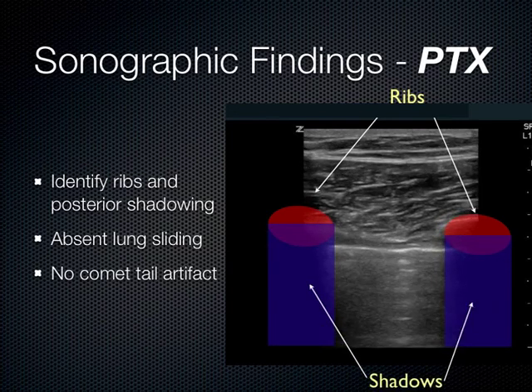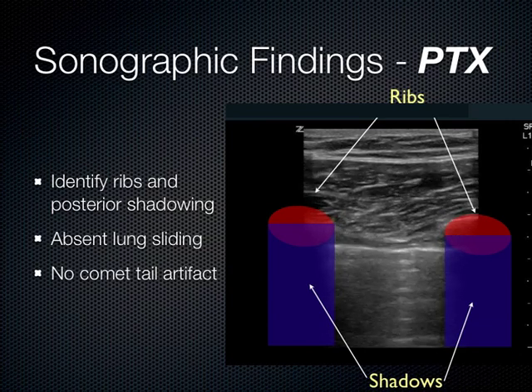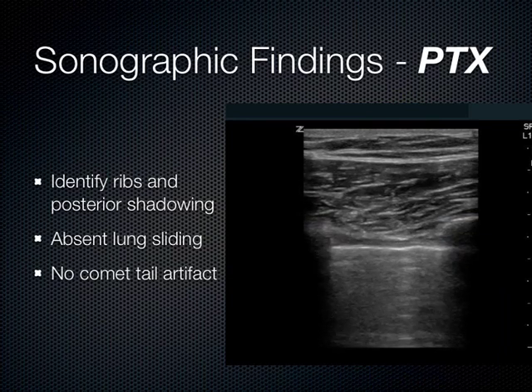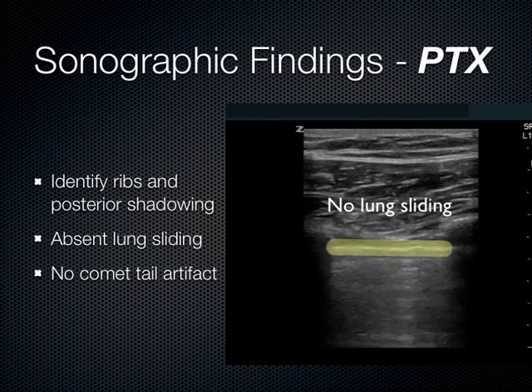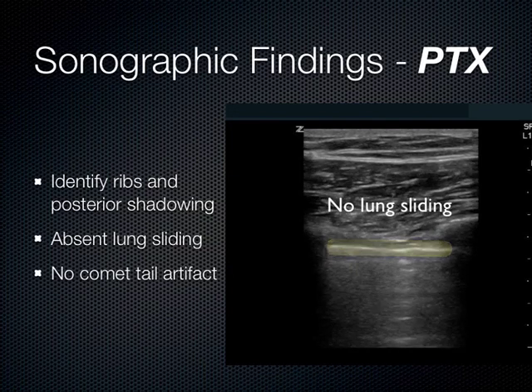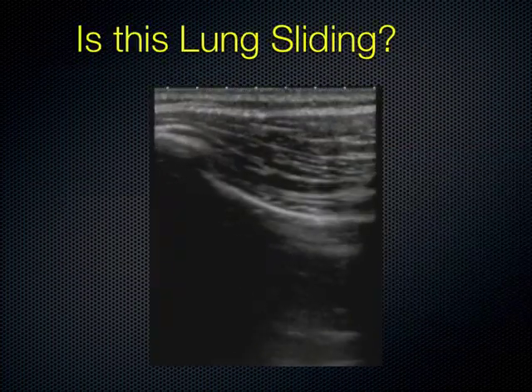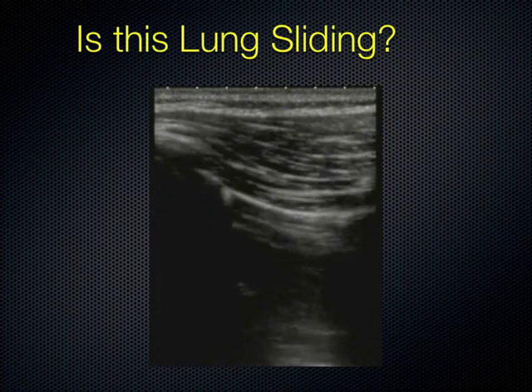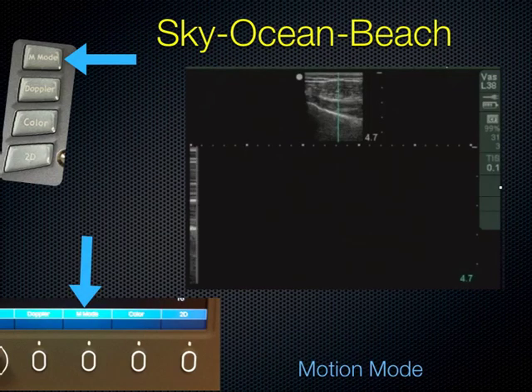Okay. All right. Moving on. Just a couple examples. Is this lung sliding? Yes. So, pneumothorax or not? No. Good. You're experts now. Very easy to get the image. You will all be flying through this and then looking at kidneys and hearts later today because it's very easy to get the image. Okay, so we're moving on to the M mode.